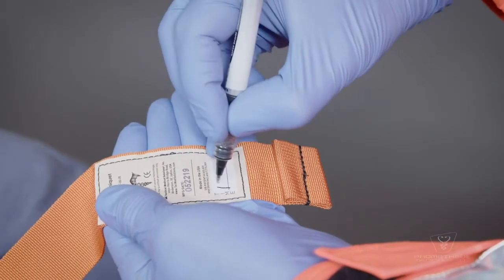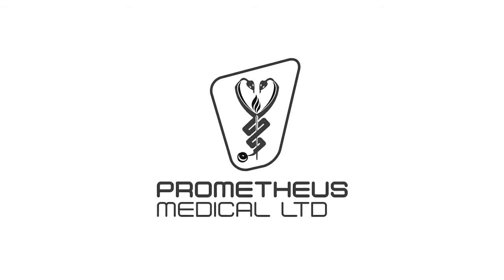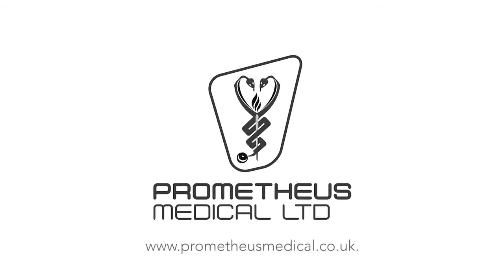Make sure to note the time of application and write it into the space provided on the tourniquet. Always consult the full instructions for use for warnings and precautions before using this device.